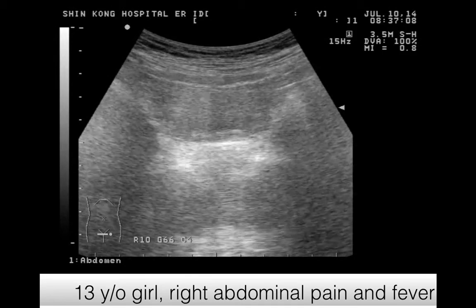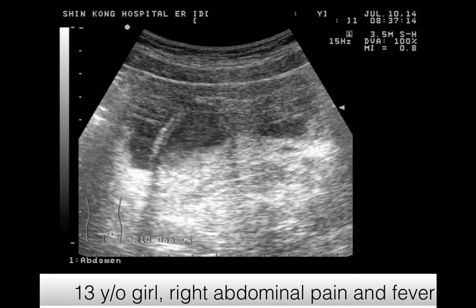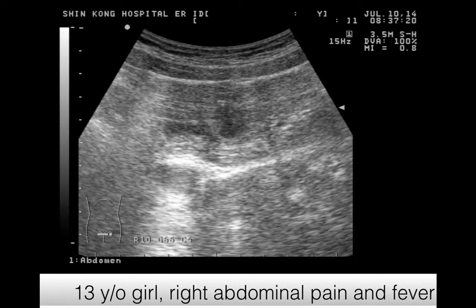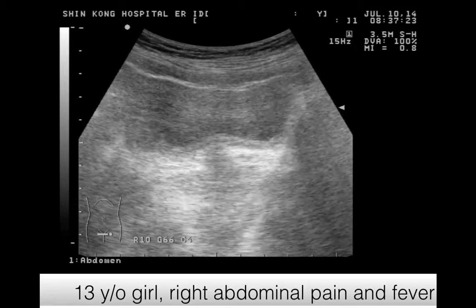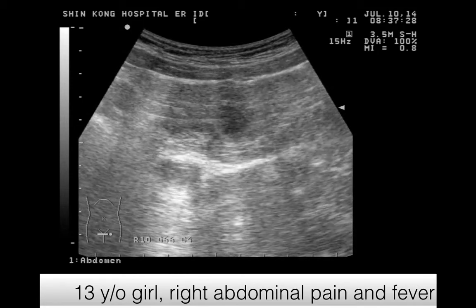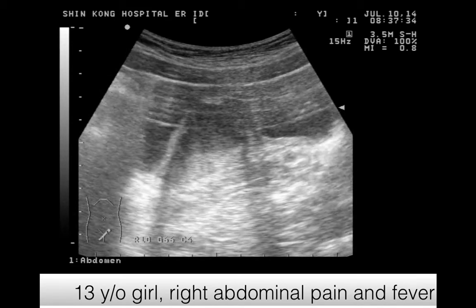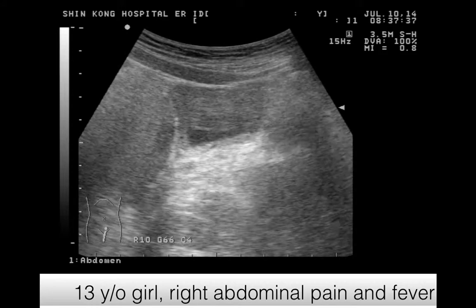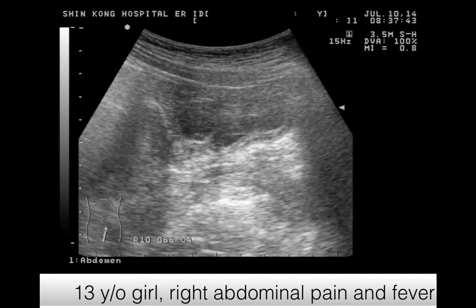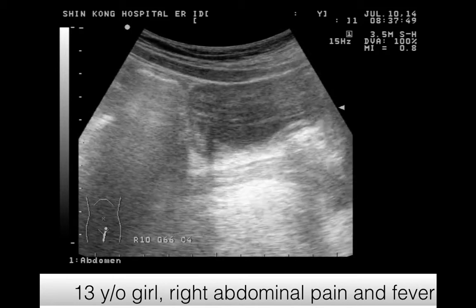See again, because it is unique. I only got one video. Bladder, transverse view. A cystic outpouching inside. Can you see the connection of each two? Here. When we rotate it, it's uterus, bladder, and to the right side of her body, we can see this outpouching and fluid inside and out.